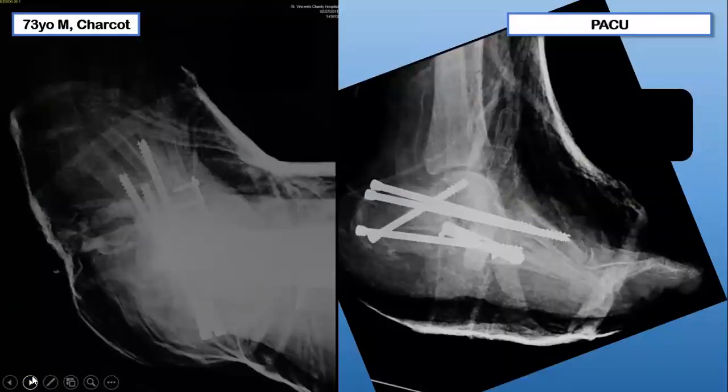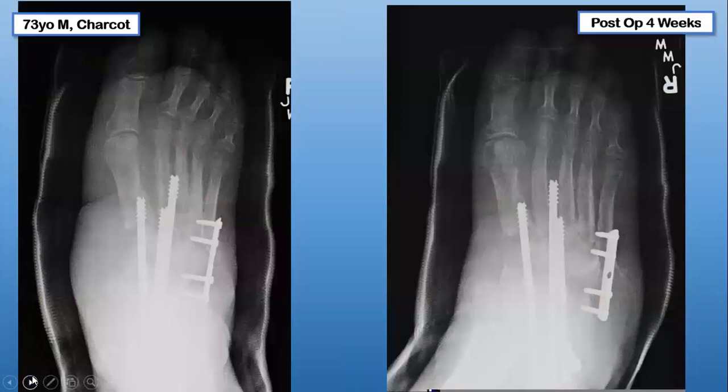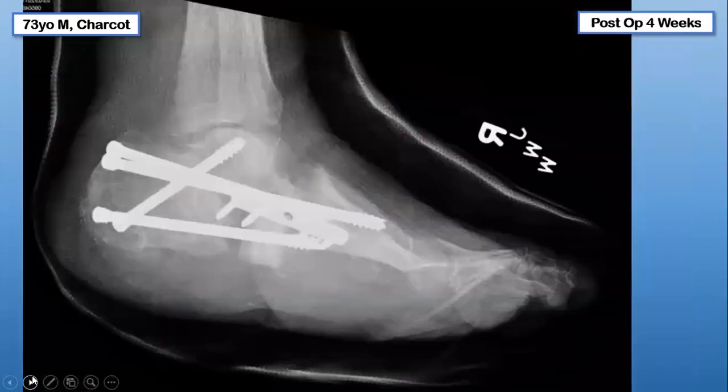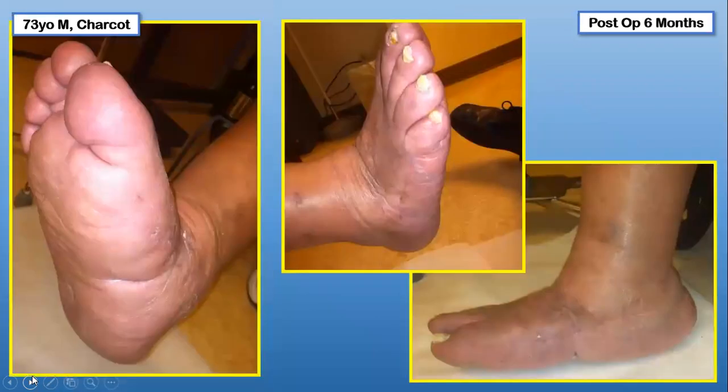Here, it's a nice little recreation of subtalar joint fusion, a midfoot fusion, lateral and medial column beaming with these headless screws, and then plates on the medial portion for some extra construct. Skipping through here, the patient went through multiple cast changes, was placed into an AFO brace, and then around 12 weeks post-op, we finally got him to start walking again.